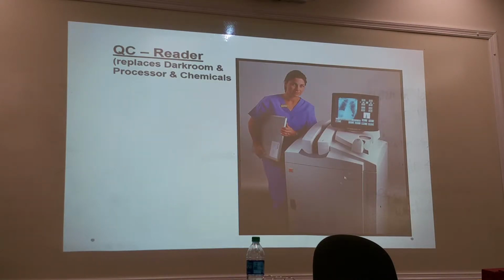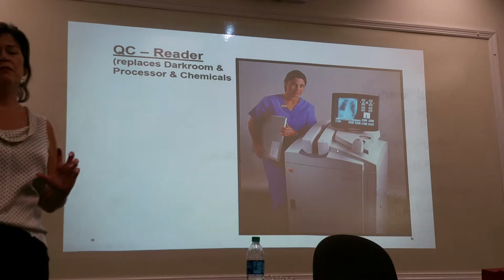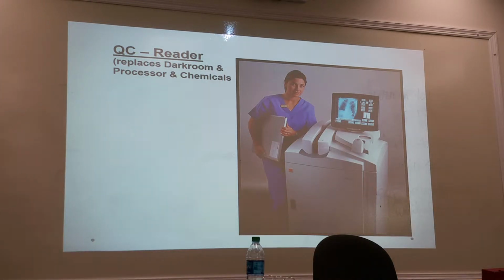But so now here's an imaging plate reader, and you still have these at some of your hospitals. Quite a few of your hospitals will still have maybe one CR reader.